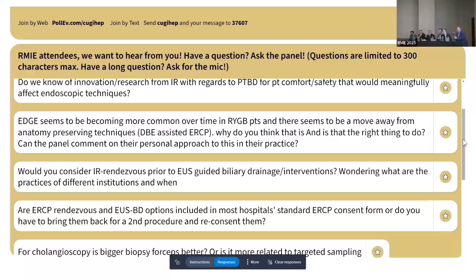Absolutely. Dr. Binmoller, you wanted to ask. Hi there. I couldn't resist after that beautiful comment that was just made, because it resonates so much with me, in terms of what inspired me to develop the LAMS. It wasn't to enable pseudocyst drainage or walled-off necrosis drainage. We could do that actually previously. It wasn't to drain the bile duct. Of course, ERCP could accomplish that, PTCD as well, but it was to preserve the gallbladder. So that was what inspired me.